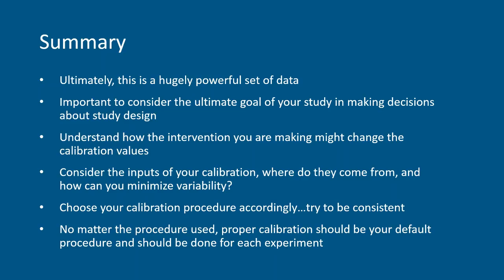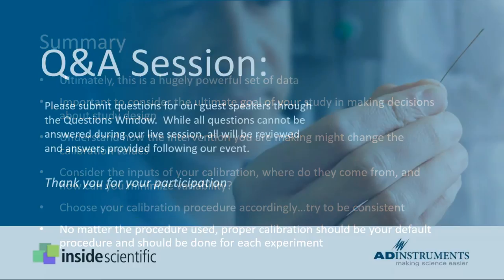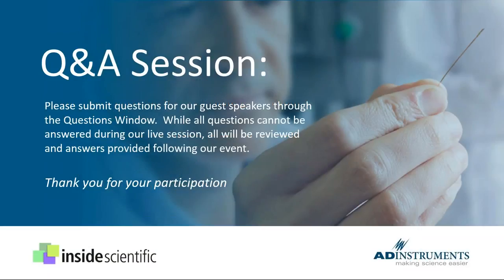Whatever that is, you try to be consistent from animal to animal. You may not need to verify in every animal, but sometimes make spot measurements within an animal to make sure that your values seem reasonable. And I think in the end, for me at least, from my experience, a proper calibration should be your default procedure and ideally should be done for each experiment. So without further ado, let's move on to our Q&A session.